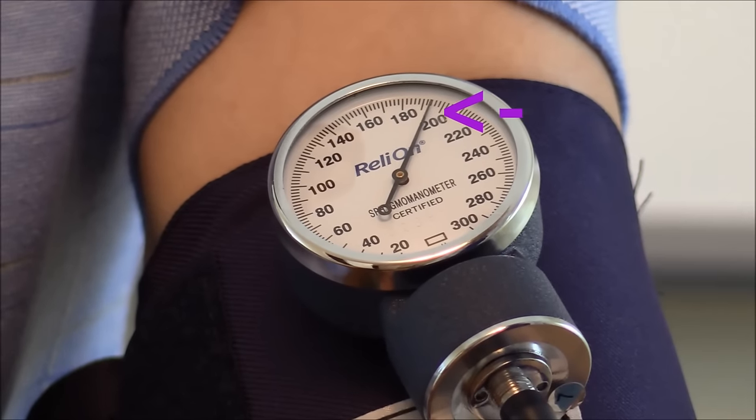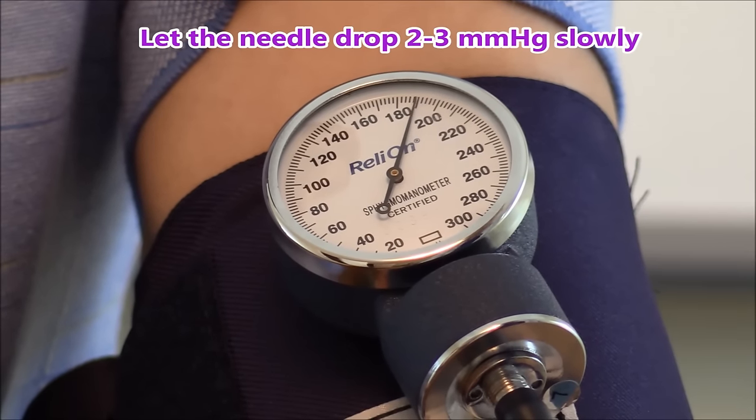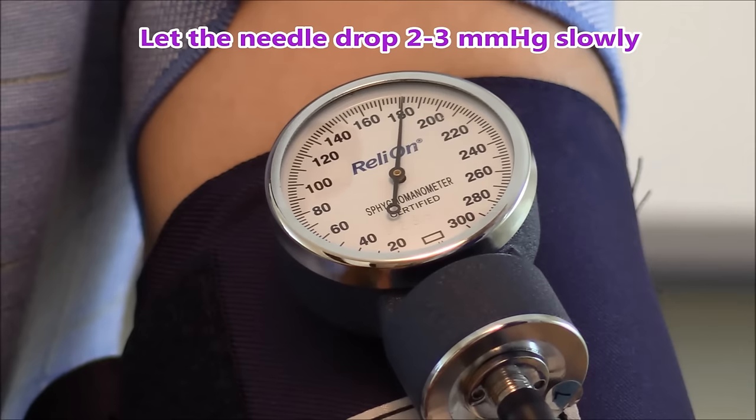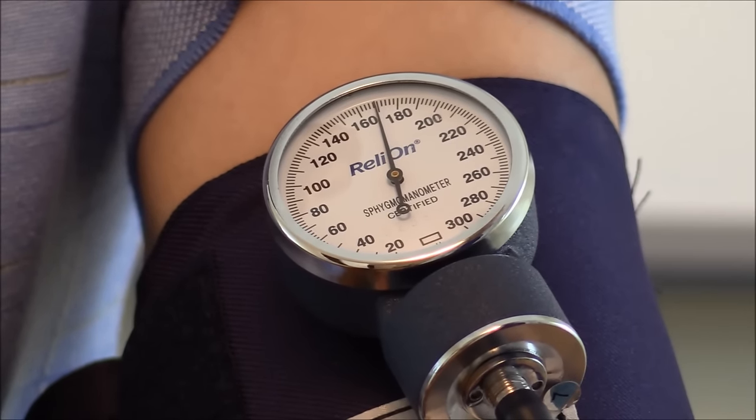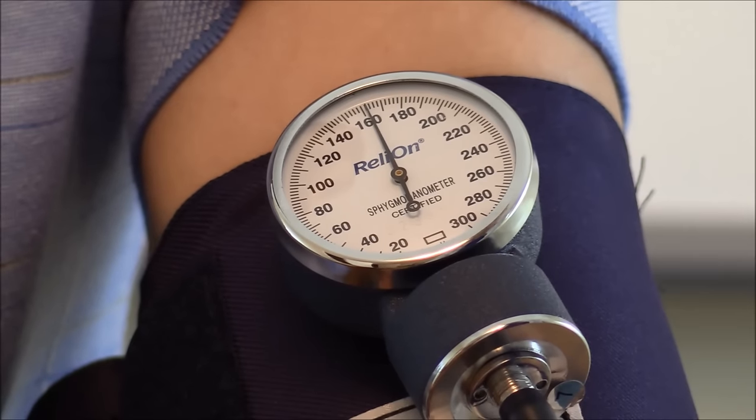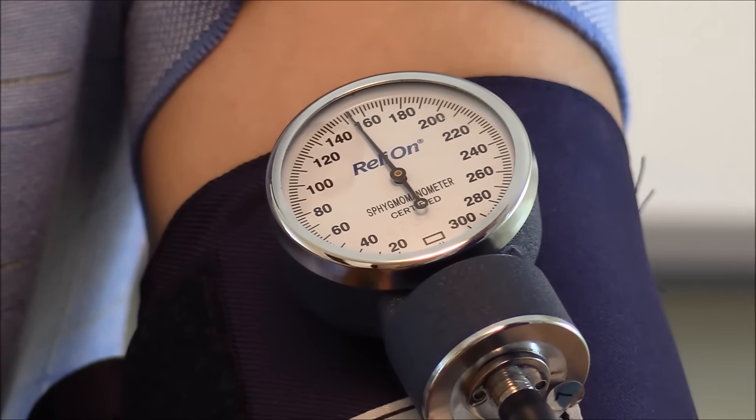Now we're going to let the needle drop about two to three millimeters of mercury slowly, not too fast not too slow, and we're listening for that first sound and that first sound will be our top number of our blood pressure which is our systolic. I haven't heard it yet and I'll let you know whenever I hear it.